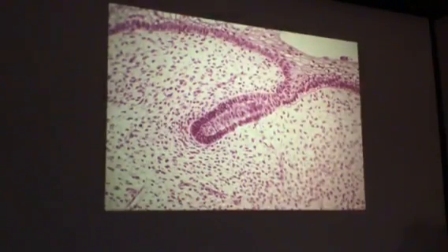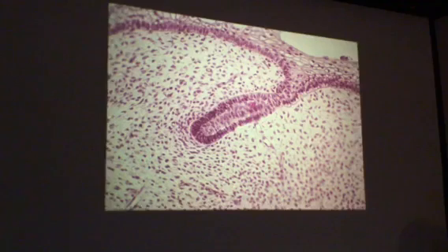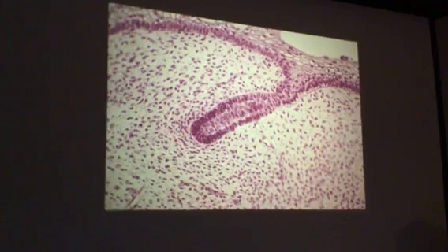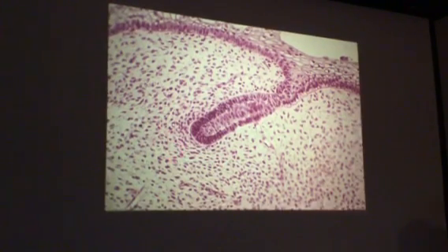And right there we can follow a line going all the way around, and that would be what? Basement membrane separating this structure from this tissue, and this tissue would be what? Ectomesenchyme. Don't really see the dental follicle yet, but this is ectomesenchyme.